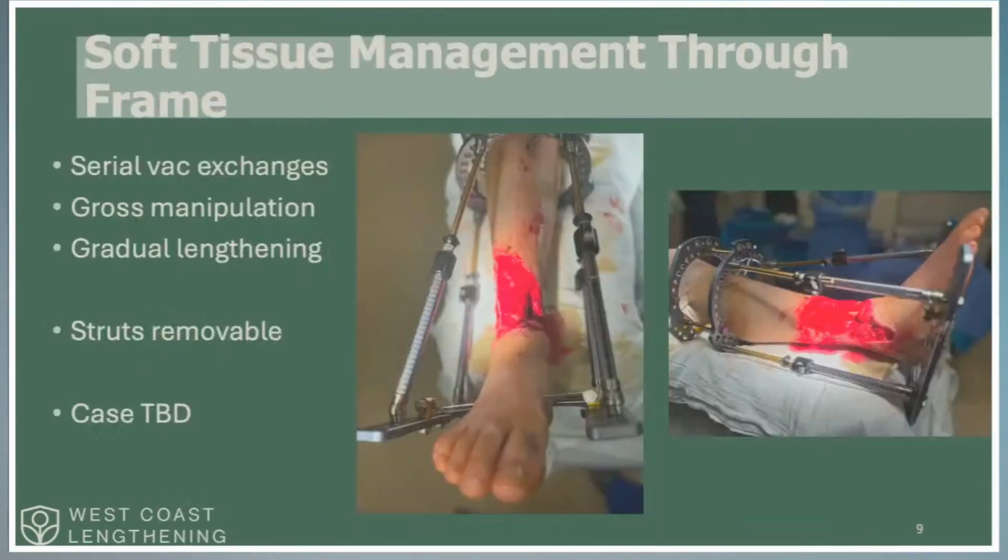And then I converted him to this simple frame. The transcalcaneal pins are going to erode through the calcaneus fairly quickly, so I often convert to a thin wire frame if they're going to be prolonged. But this is nice, even a ringed external fixator allows very good access to this wound. So if there's going to be an external fixator on for longer than 3-4 weeks, I'm converting them to a thin wire frame, at least in the distal portion.